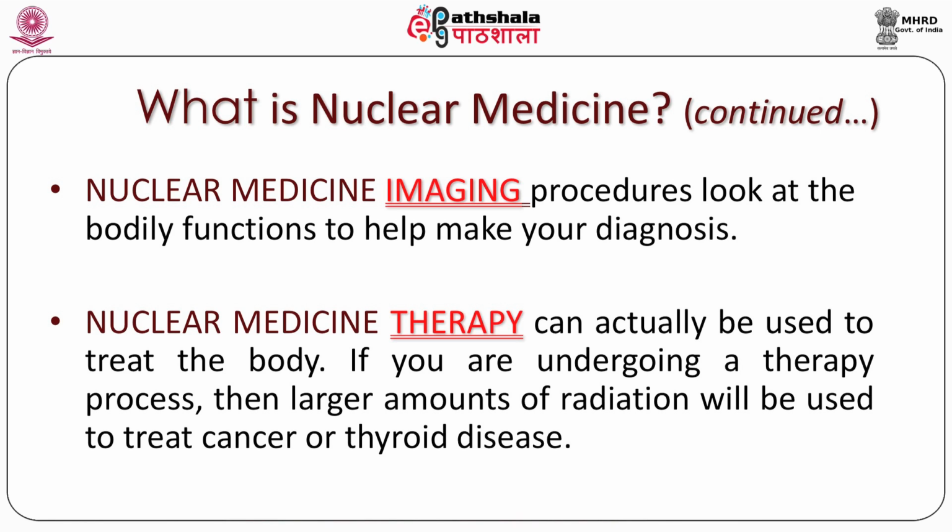X-rays, CT scans, MRI give a good anatomical picture, they can show structure, and by this we can diagnose the disease. But apart from that, for getting the function of the body, the function of the organs, nuclear medicine plays a very, very important role. It can be used for therapy purposes also.